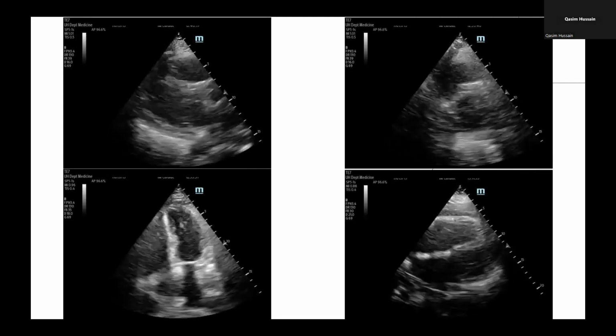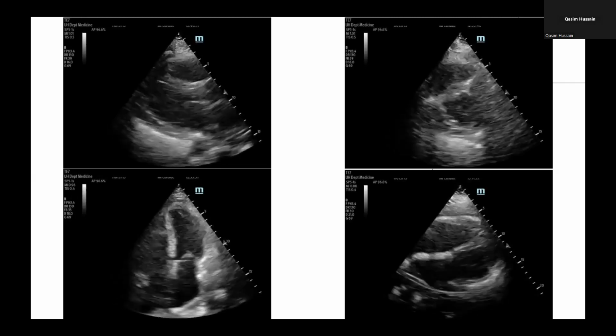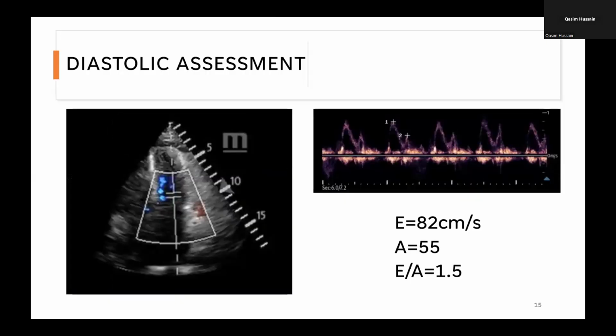But now with diastology in my tool belt, we furthered our assessment to truly see if she would respond or would be able to tolerate these fluids. So now the first step of the diastolic assessment, we took our pulse wave Doppler and got our mitral valve inflow view. And these are what the waves look like in real life. So we have our nice E wave, E velocity coming up, that nice big spike.